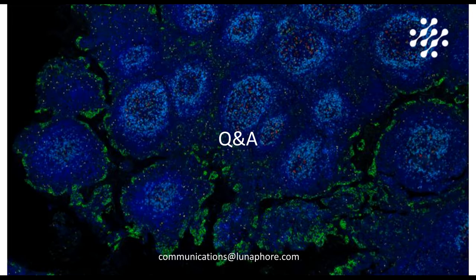Well, yes. So LabSat performs all the staining steps of the protocol, and everything that's related to imaging has to be done outside of the LabSat. So I would say that it's compatible with any microscope that is equipped with the right multispectral camera.